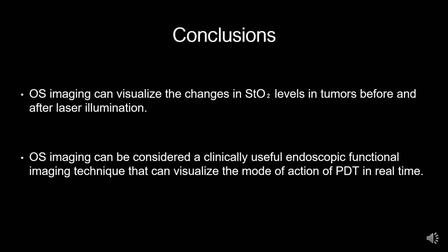OS imaging can visualize the changes in StO2 levels in tumors before and after laser illumination. OS imaging can be considered a clinically useful endoscopic functional imaging technique that can visualize the mode of action of PDT in real time.